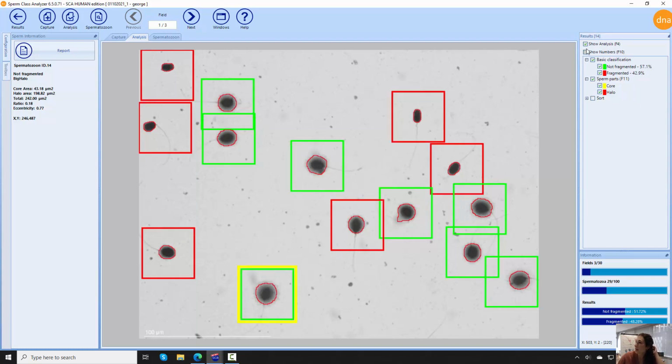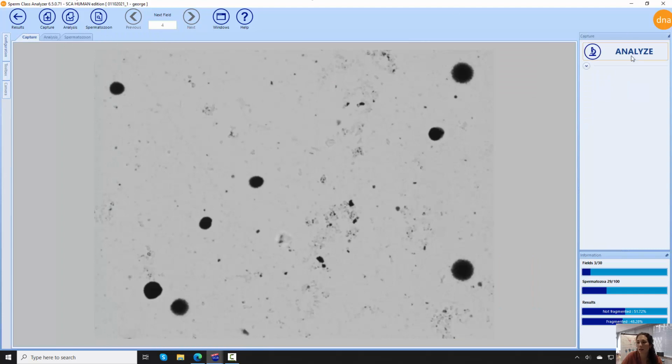Fragmentation analysis is not a basic routine analysis, but when maybe the other sperm assessments, the other sperm parameters are normal, in some cases the problem could be linked with DNA fragmentation, not just in problems related with fertilization, but also with embryo development. So this is a more advanced analysis, but in the last years it has gained some importance, and more clinics are running this test lately.